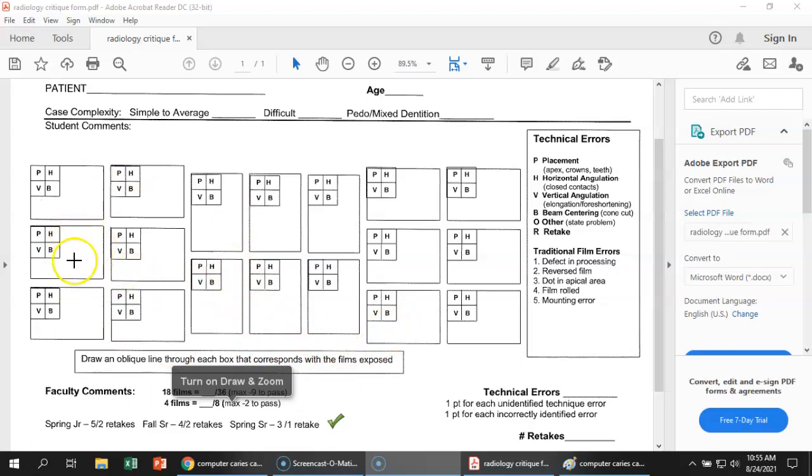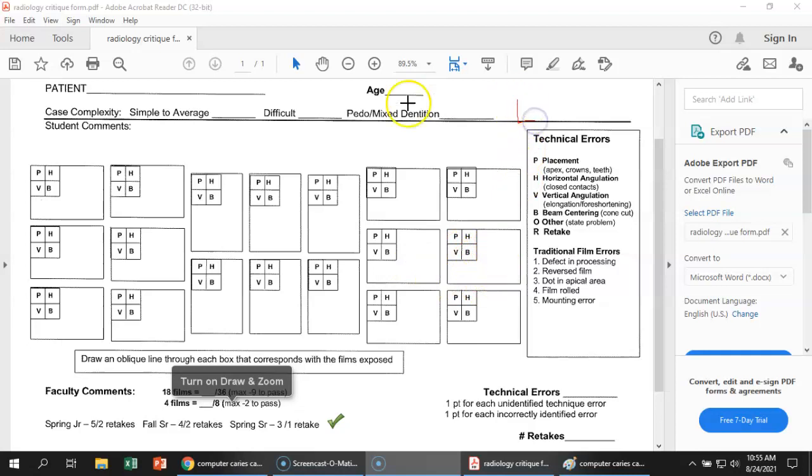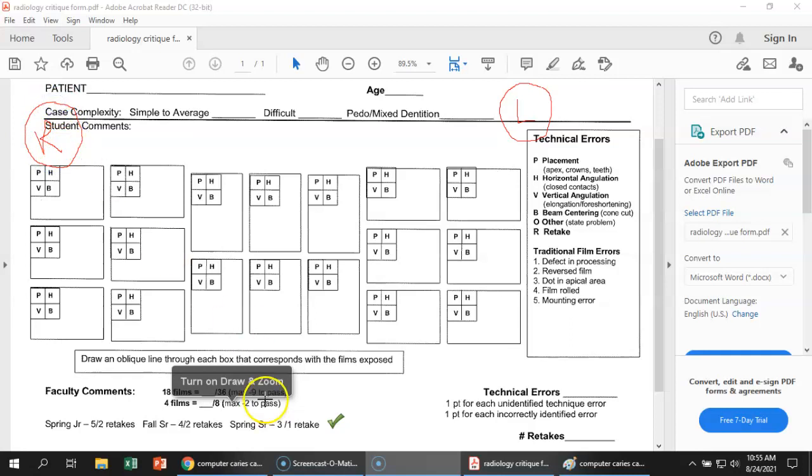So this is the right molar bite wing. This is the right premolar bite wing film. Jump over here to the other side. This is the left premolar bite wing. And this is the left. And this is the right side. Because you are looking at the face of the patient. It's basically how you're face to face.